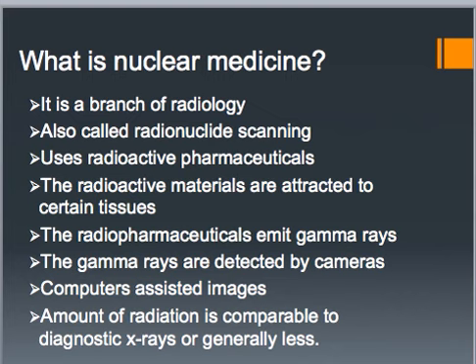The radiopharmaceuticals are specifically formulated to be collected temporarily in the specific body part that needs to be studied, so the heart, or the lungs, or the liver, whatever it is that they're trying to visualize. Those radionuclides are taken up by the organs in the body, that's called the uptake, and then they emit a faint radiation signal, which is measured by the gamma camera. Like I said before, the difference between X-ray, CT, and nuclear medicine is that the nuke med camera does not emit radiation. It picks up the radiation that's within the body from the radiopharmaceuticals that were inhaled, ingested, or injected.